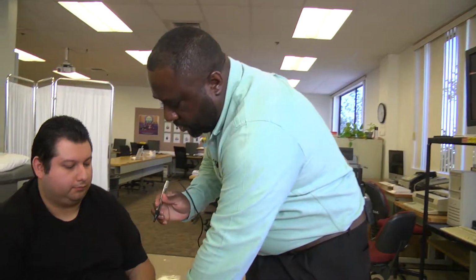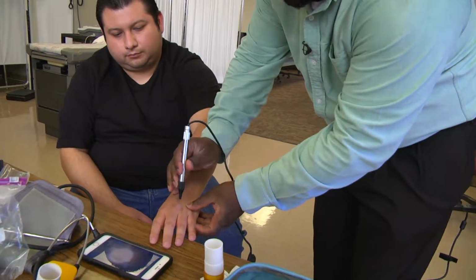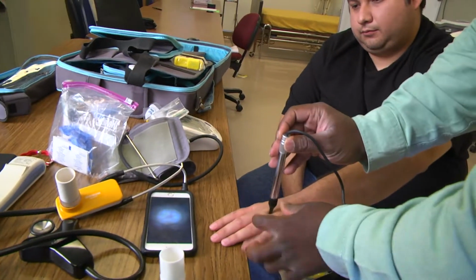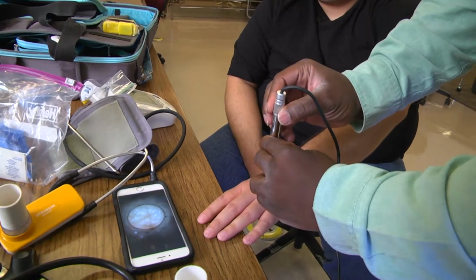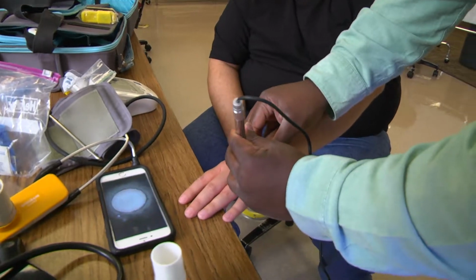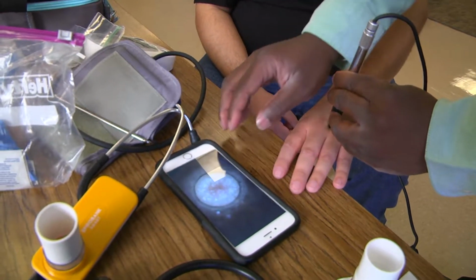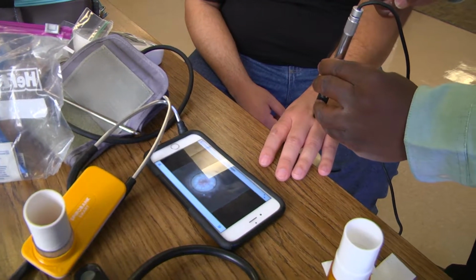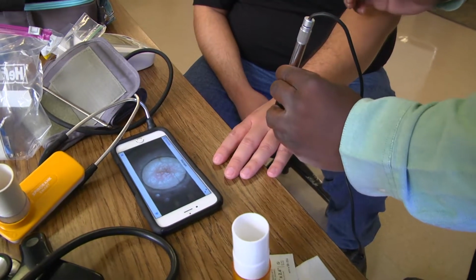So say Balthazar had an issue with the skin. So I go here, and then I'm going to focus. I'm going to look at the little mark right here, zoom in on it, and take a picture.